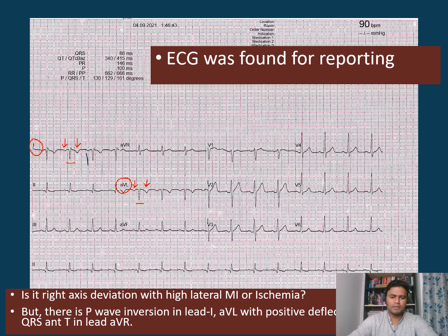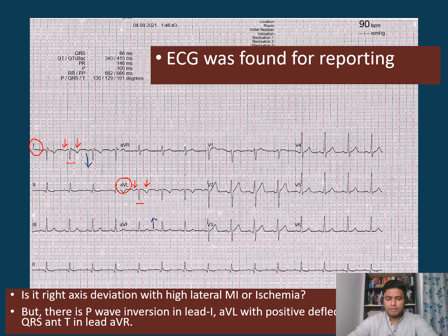Is it only right axis deviation with high lateral MI? As you can see, lead I is going down and lead AVF is going up — this is right axis deviation. The T inversion in lead I and AVL may indicate high lateral ischemia or possibly non-STEMI. So although those are possibilities, the inversion of the P wave points to something else.